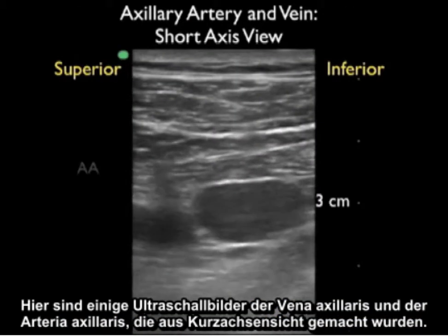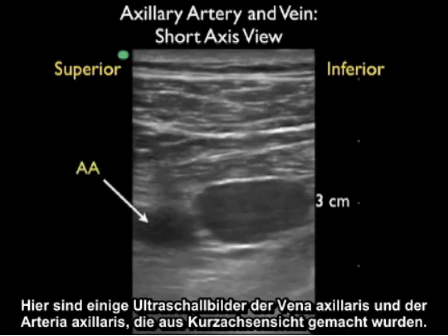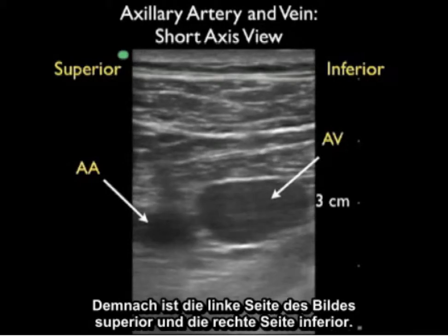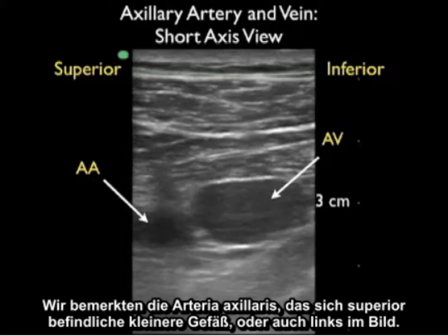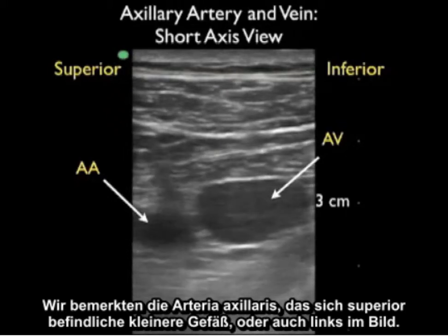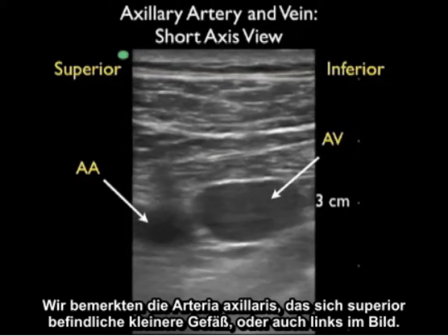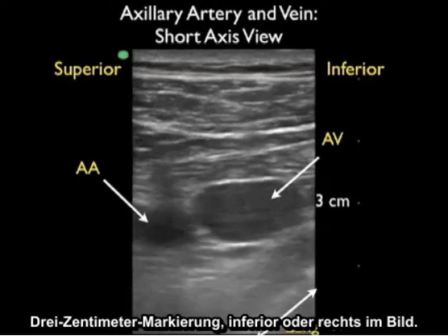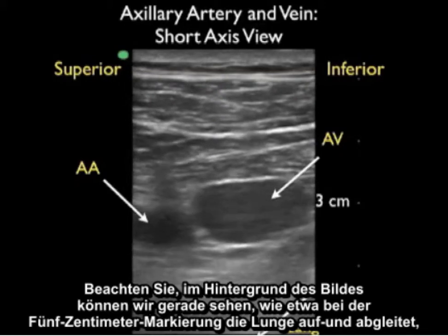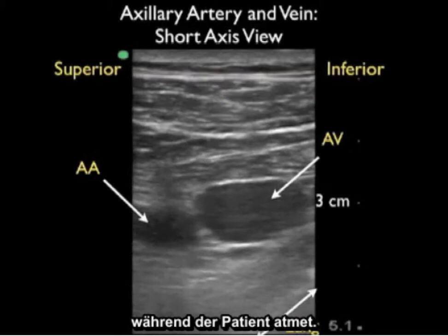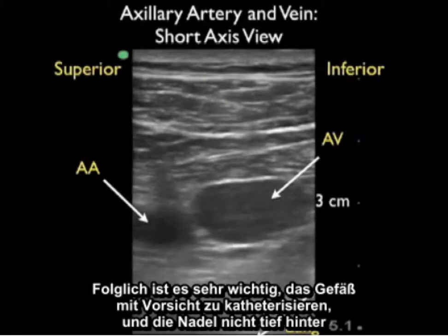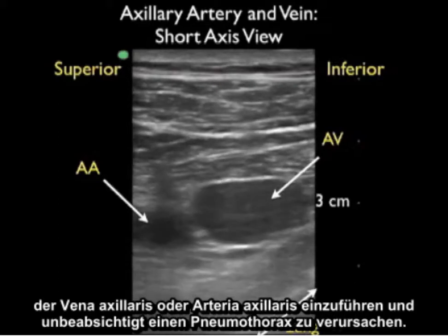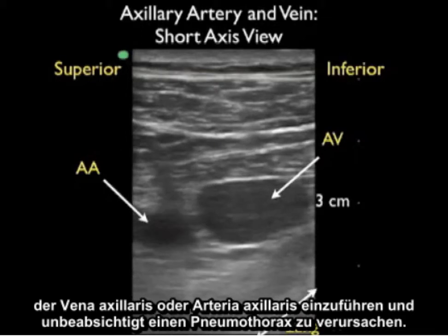Here are ultrasound images of the axillary vein and artery taken from the short axis view, with the probe marker oriented towards the patient's head. To the left of the image is superior and to the right is inferior. The smaller axillary artery is seen superior or towards the left. The larger axillary vein is at about the 3 cm mark, inferior towards the right. Towards the back of the image at about the 5 cm mark, lung sliding is visible as the patient breathes — it's very important not to pass the needle deep past the axillary vein or artery to avoid an inadvertent pneumothorax.